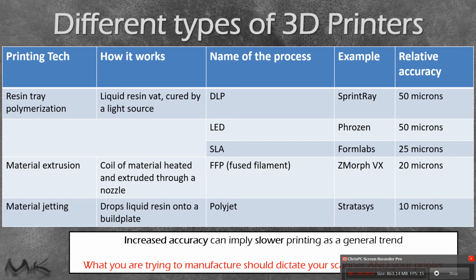If we're looking at the scanners we talked about earlier, and we looked at that one article, 75 microns was our least true and accurate scanner. Well, still, that meets the needs of the majority of our removable dental needs. When we start to get into full arch fixed implant types of bars, then maybe we need a little bit more accurate printer.